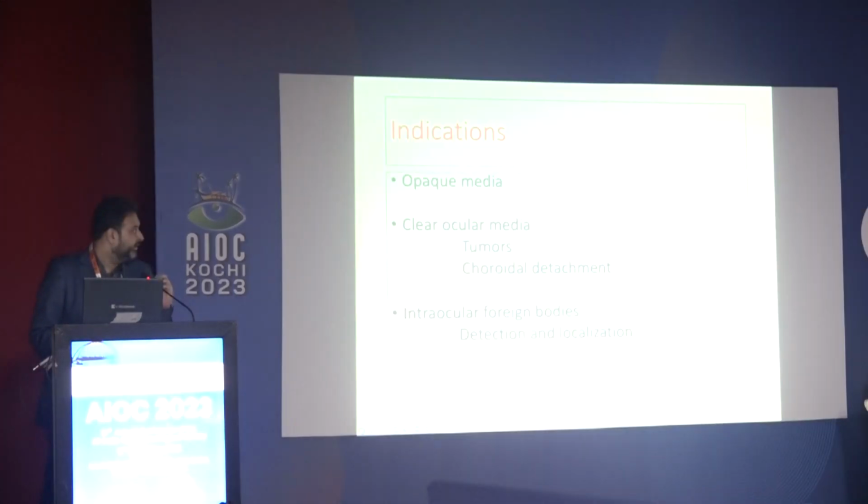You want to definitely do it in ocular tumors. It's both diagnostic and also prognostic for follow-up. In cases of ocular trauma, I think it's a must. Intraocular foreign bodies, detection and localization.